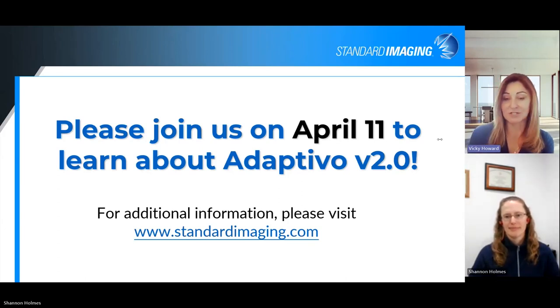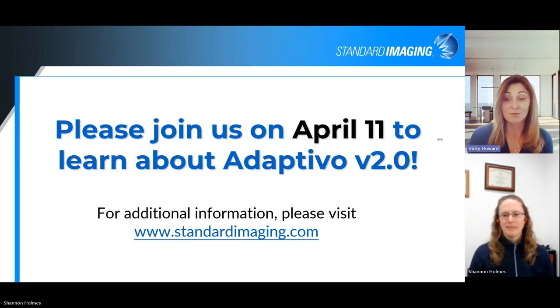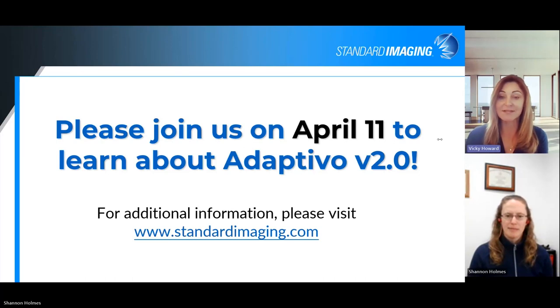You can interject too, Shannon, but yes, that is correct. Some older panels do have a harder time and can't do integrated imaging with a 6 FFF. So that is an issue, but most modern panels can handle that just fine. There are some issues with saturation for the commissioning process, but positioning the panel appropriately for some of those measurements assists with that. Do you have anything else to add, Shannon? No, I think that pretty much covers it.